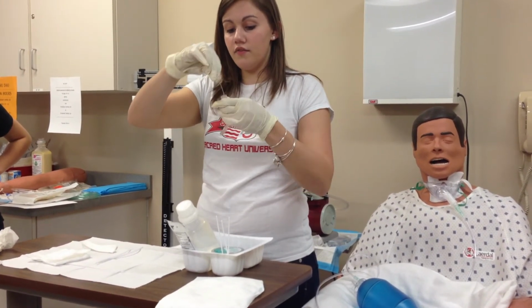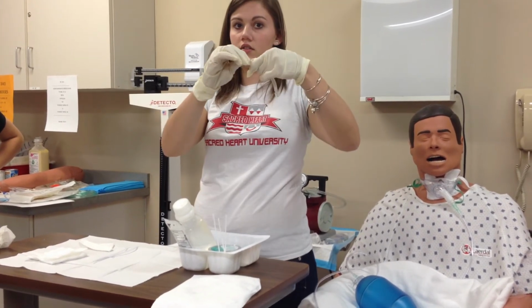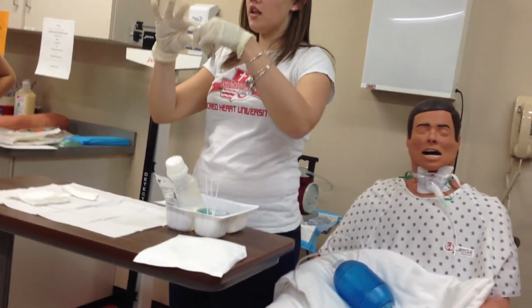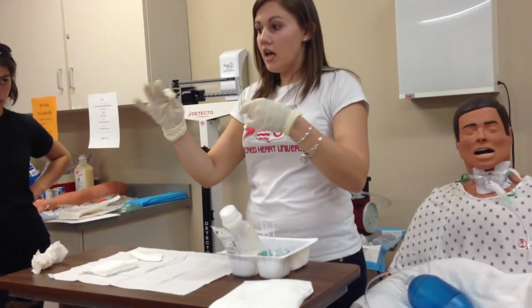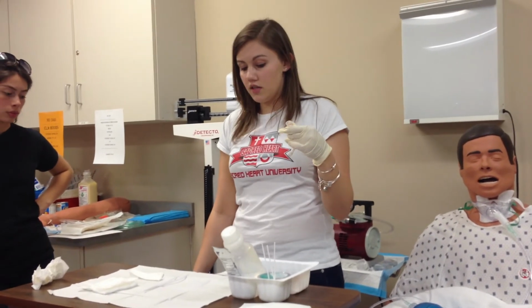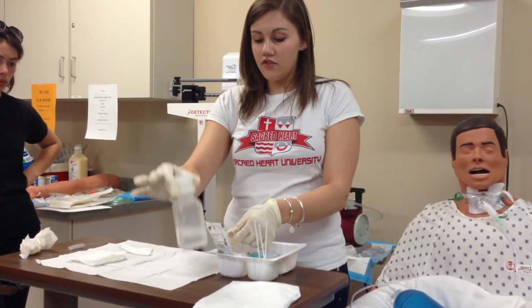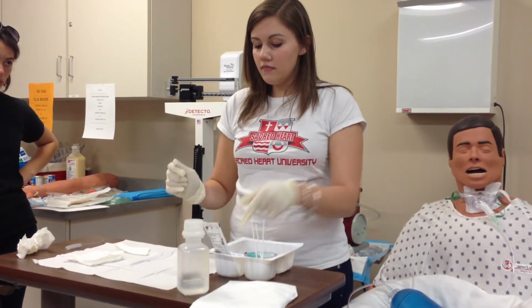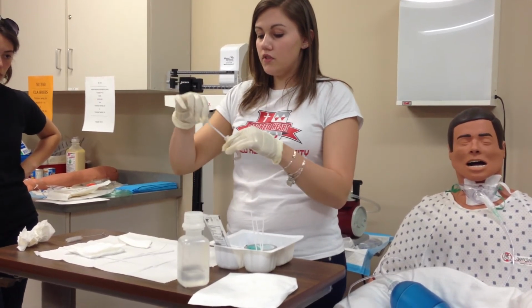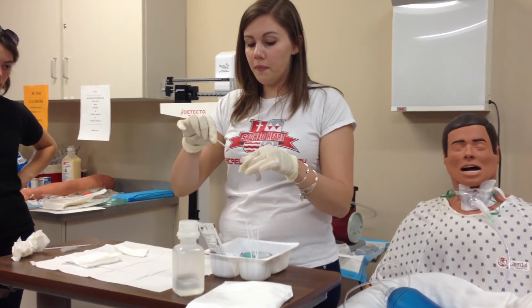for argument's sake. You've gone through and you've done this. Never go like this though, because now you've just contaminated your hand. See, because this is your sterile hand and it's touching the catheter. Okay, so you clean it. I would say bring a garbage so you have one right below you so you can just throw stuff away as you're using it so you don't contaminate yourself. Then this goes in the half strength. And then technically this is where you dry this all off and you can still touch everything on here because this hand is still sterile.